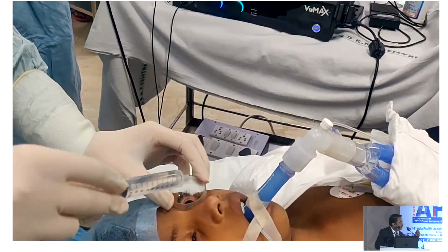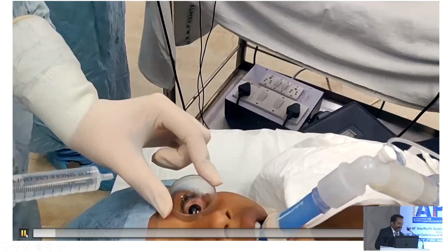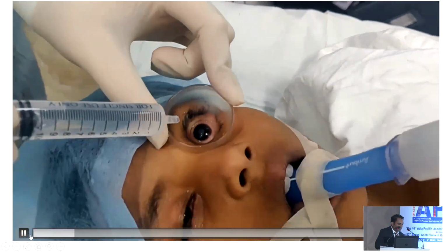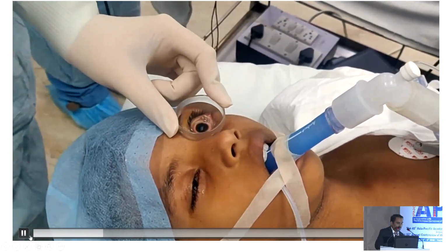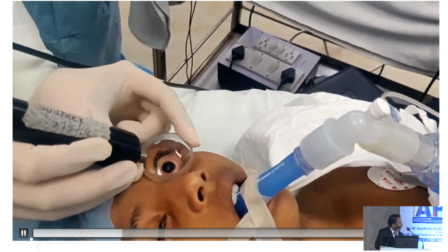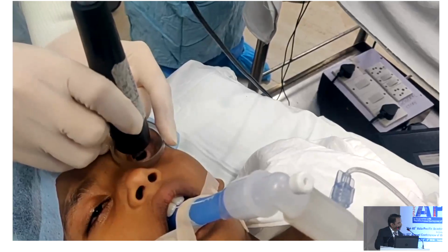Make sure that you are not going to rub or touch the cornea. You are not going to cause any corneal haze or epithelial defect. So once you put that, you are going to slightly indent on the sclera so that it should not be leaky. After that, you are going to inject the saline, right? So you are going to fill it. You can fill more than 50% of the total cup height. After that, you are going to take the probe and insert it into the liquid. After that, you are going to press on the monitor to start the scan.